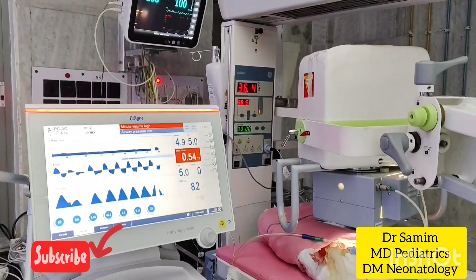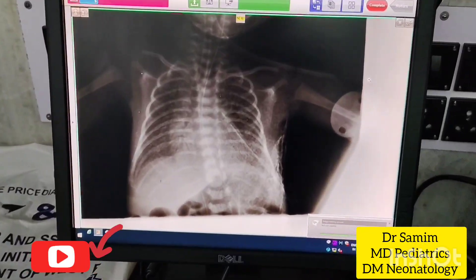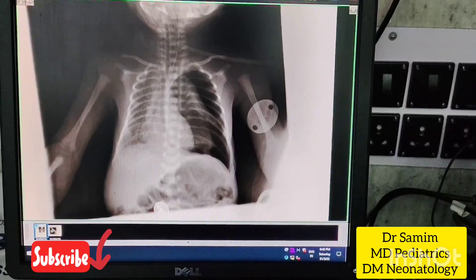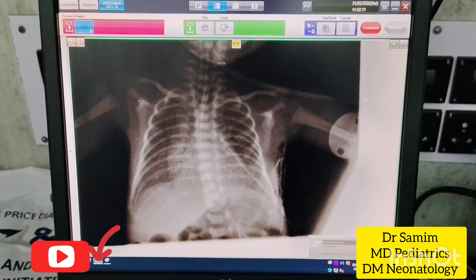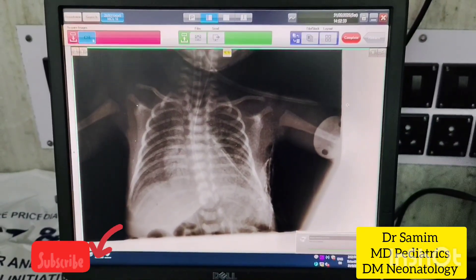Now we are doing a chest radiogram to see the position of the ICD tube. This is the chest radiography before ICD placement, and this one is after ICD placement.